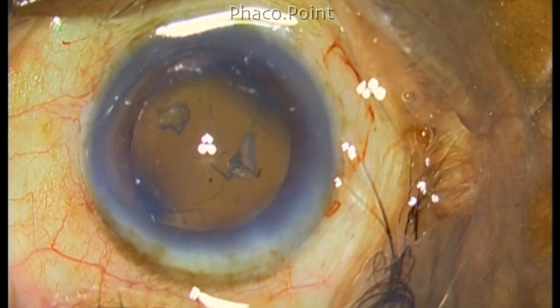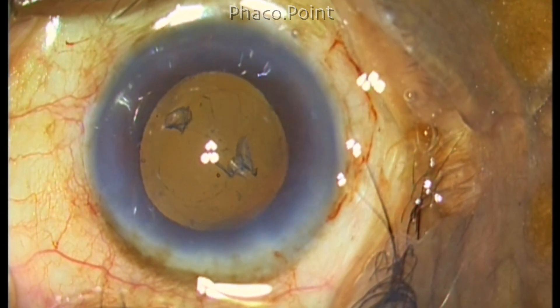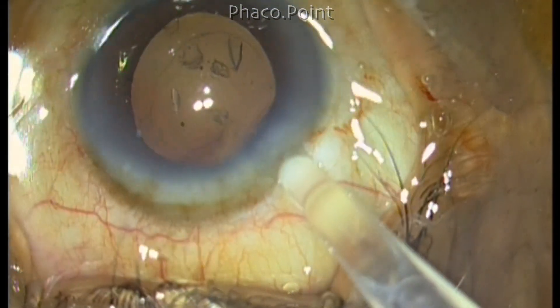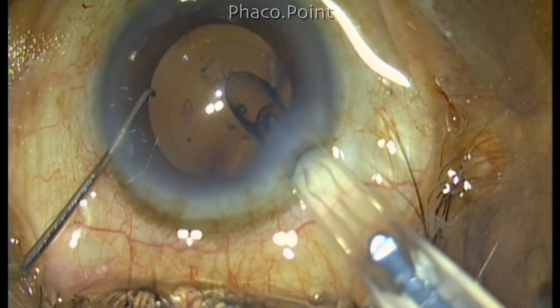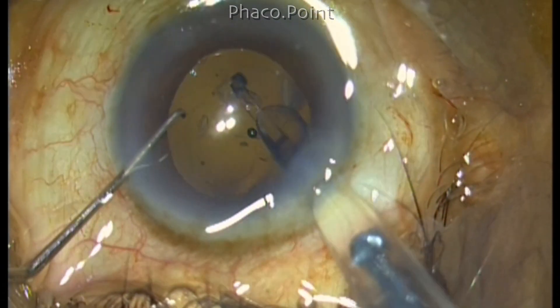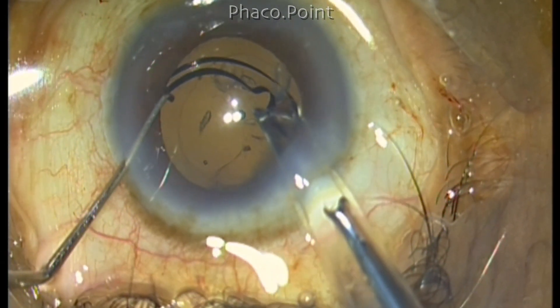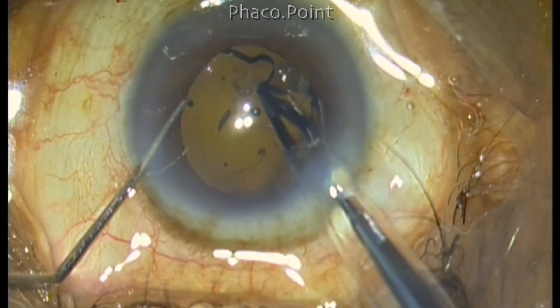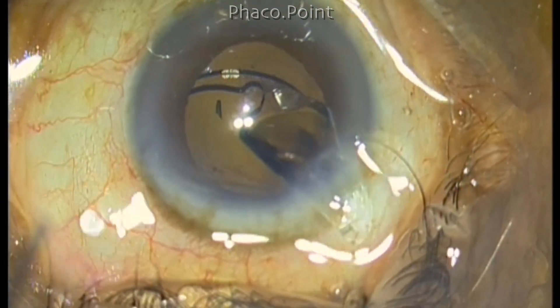Since there was no cortex at all because of a very good cortical cleavage hydrodissection, I decided to put in the single piece hydrophobic acrylic lens inside the capsular bag. This is a Tecnis lens. My OT assistant loaded the lens in a wrong fashion, so as it emerged from the eye the haptic was actually facing up, which required that I turned the nozzle around almost 180 degrees to deliver the lens. In so doing, I delivered part of the lens outside the clear corneal incision.